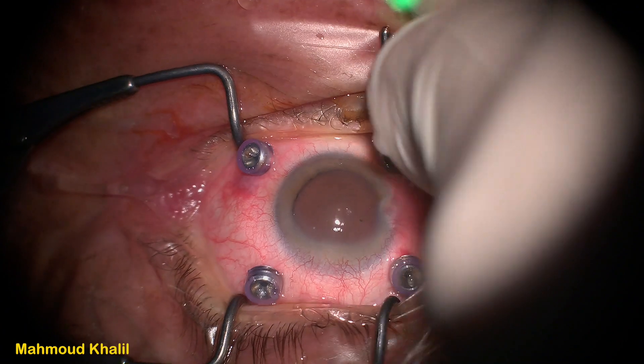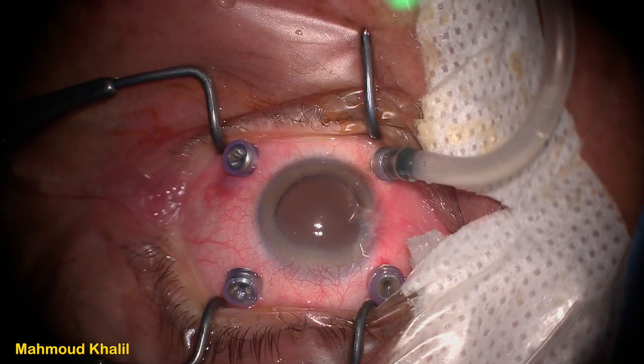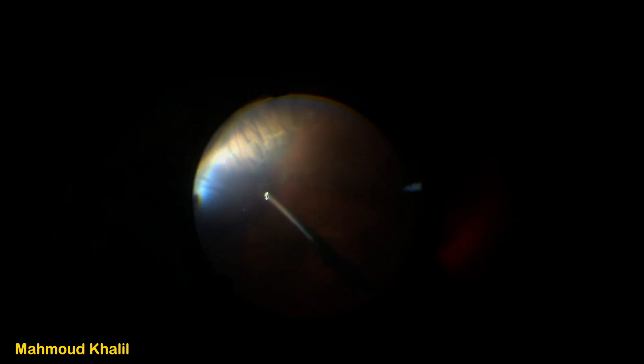After checking the light probe inside the eye and confirming it is moving freely, it is now safe to place the infusion cannula in the inferonasal quadrant without complications. After fixation of the infusion cannula in the inferonasal sclerotomy and entering inside the eye, we can now see at the inferotemporal site — the site of the original infusion cannula — that the choroid is detached. This was the reason the infusion cannula could not reach inside the eye properly.